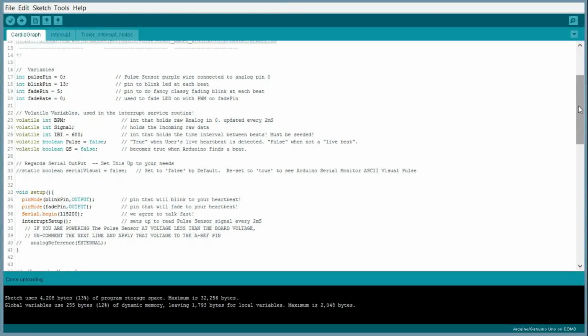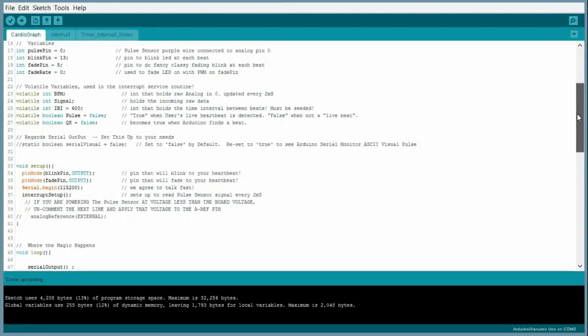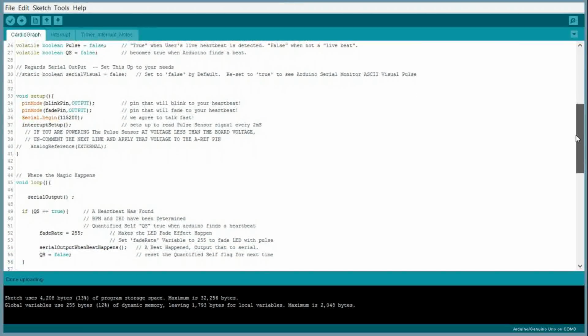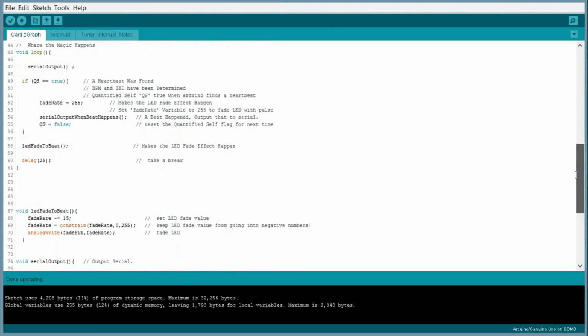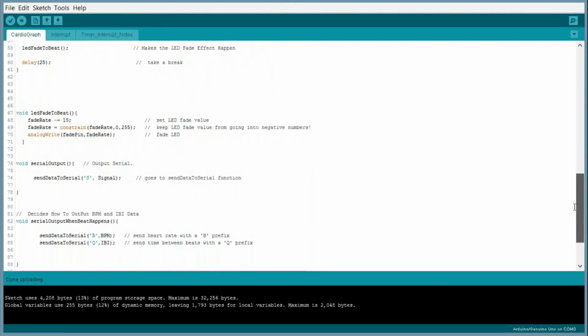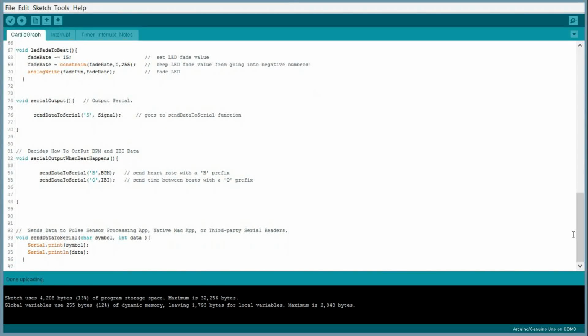You can turn it on if you want, set it up, put all the wires together. It's pretty simple, so I'm not going to go into it here. They go into all of that on their website. So I'm just going to scroll through this really quick. Like I said, I really didn't change too much. You go through your loop, it basically prints out the serial data, whether or not there's a beat or not. And this just controls some of the LED functions and setting a serial. It's pretty simple. And like I said, I didn't really change any of this.